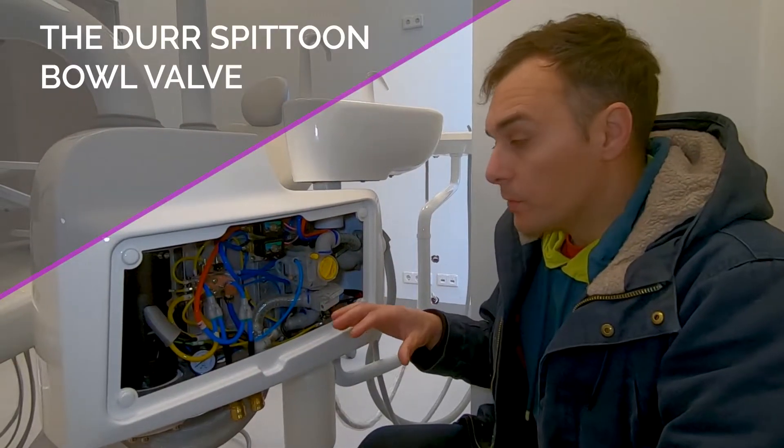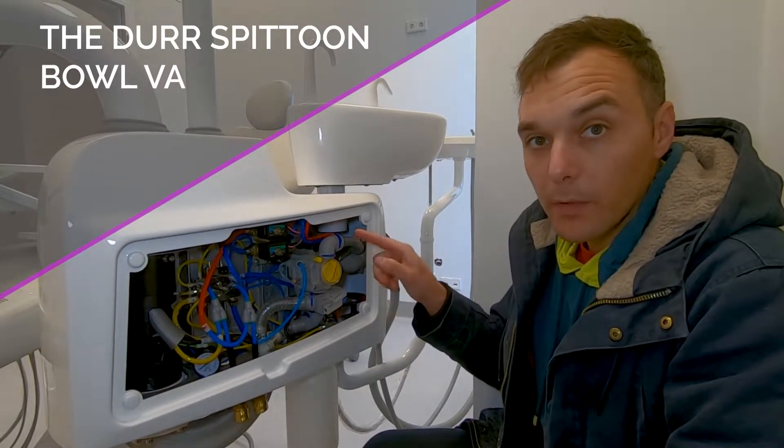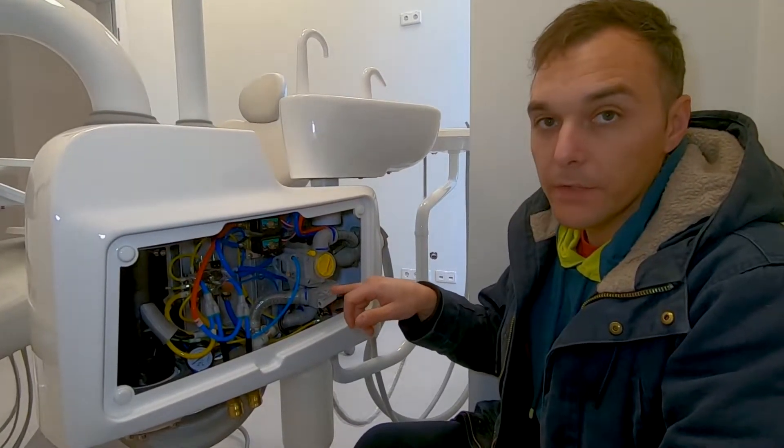In this small video we are going to show the purpose of this valve, that is the Dur-Spitum-Gol valve, and of course when you install this one you have to apply also the selection valve.